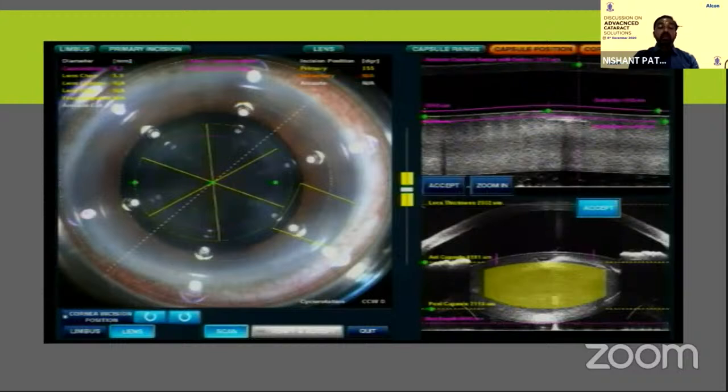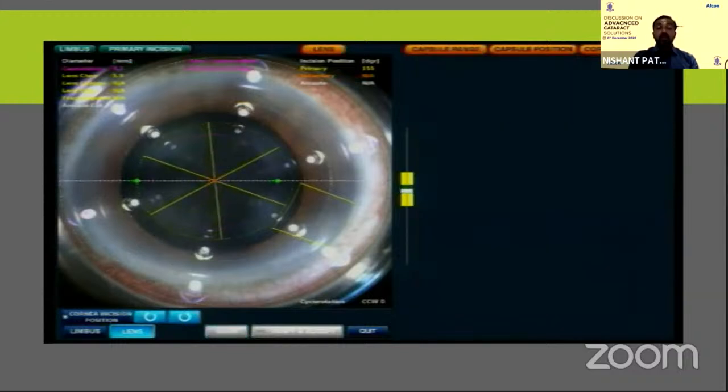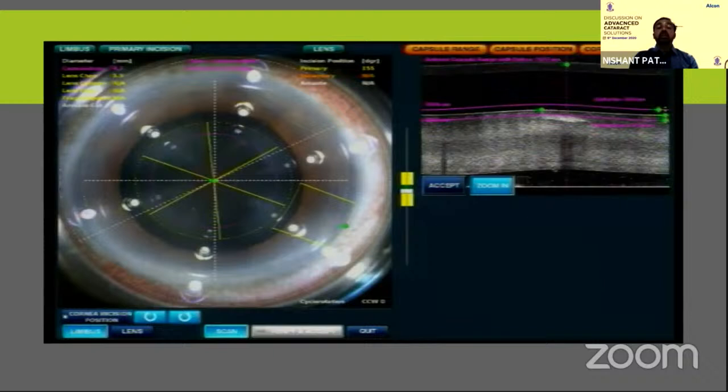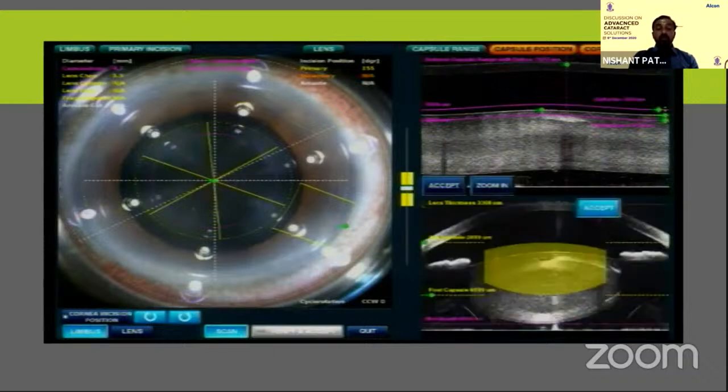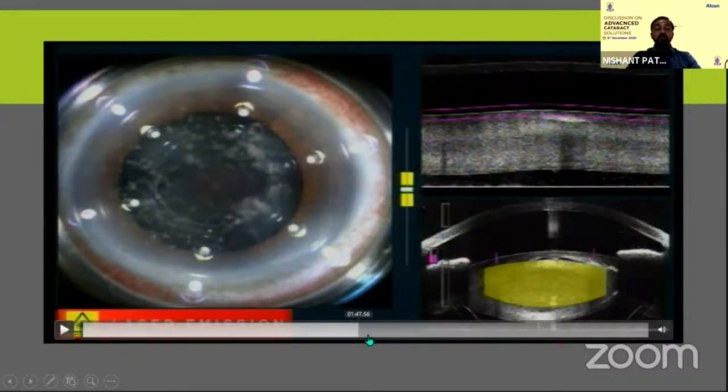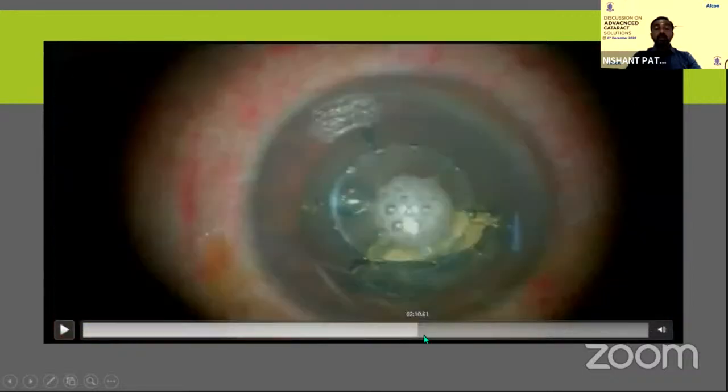The Cochrane study, where they have compared this IOL with the first generation trifocal IOL, and most of the data suggests that with the advent of PanOptix Pro toric, this is one IOL which will work wonderfully well, especially in the Indian population with a slightly short stature. So for me, this is something which is working very well. I'll just run through the video fast.